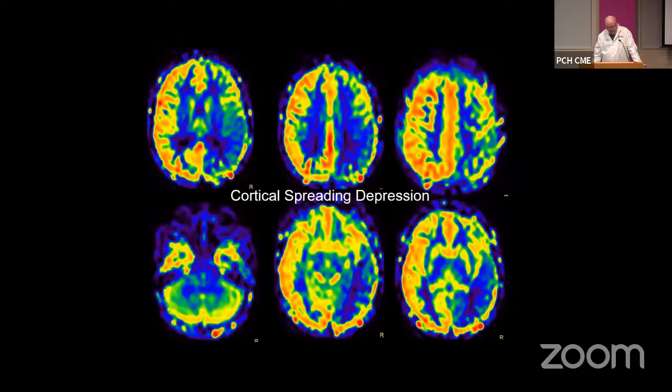But when we went to the ASL perfusion, a type of perfusion study that we do, you can see that, actually this is portrayed opposite to what normally is because of the nature of the display, the right hemisphere is well perfused. You can see good perfusion in the cortex, both medially and laterally. And then as we go up in the brain, we see that the posterior left hemisphere is severely underperfused.